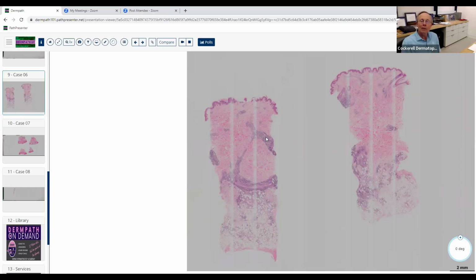So if you can look at low magnification and say, well, these are probably lymphocytes here, and I'm smart enough to know that because they're dark and jet black at low magnification and they're centered around these blood vessels, when I go to higher magnification, I'm only going to be thinking about 5 things instead of 40 things. Some people that don't have an approach are going to say, oh, this just looks inflammatory and the epidermis isn't involved, and they're not going to know what to look for. So it just allows you to be more systematic when you go to higher magnification.